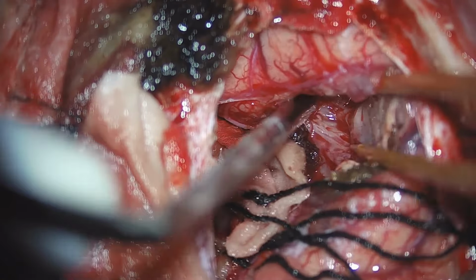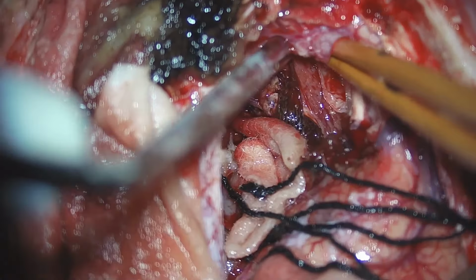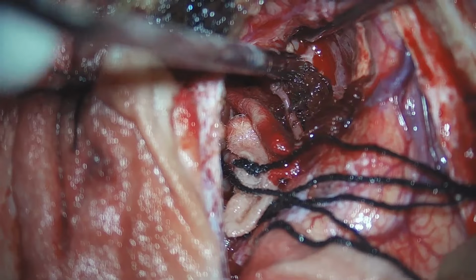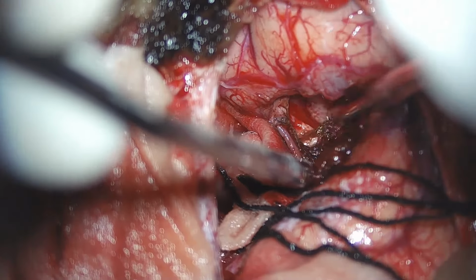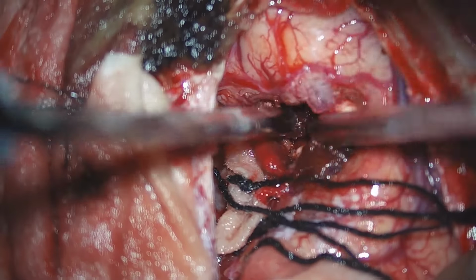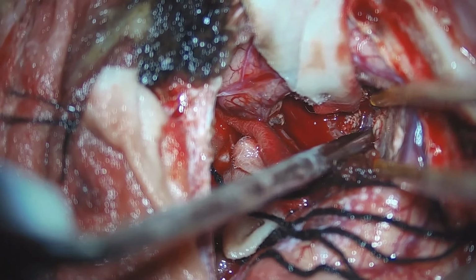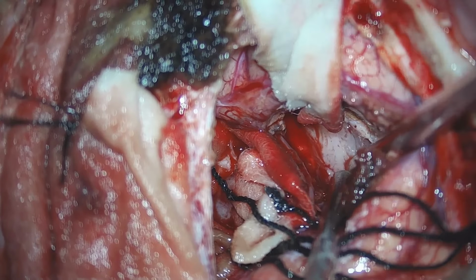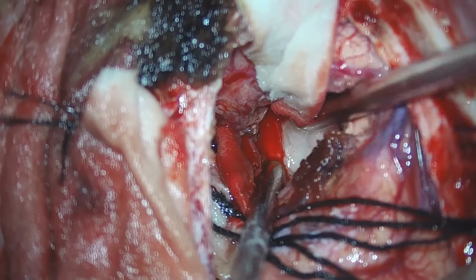Now we are again moving into the lateral aspect of the tumor and use the debrider to slowly debulk the tumor again. In every step, hemostasis has to be watched carefully. Once the debulking has been done using the debrider, we again go for creation of the plane between the tumor and normal brain.